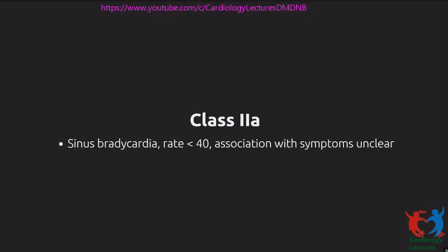So the patient says episodic symptoms, and either on a resting ECG or on a monitor or a Holter, you can see that the rate drops below 40, but the patient doesn't tell you clearly that is the time when he had symptoms. So you can assume that it's most likely caused by that and pace them. So this is a 2A indication. I'll show you later, actually, ESC has downgraded this to a 2B indication.